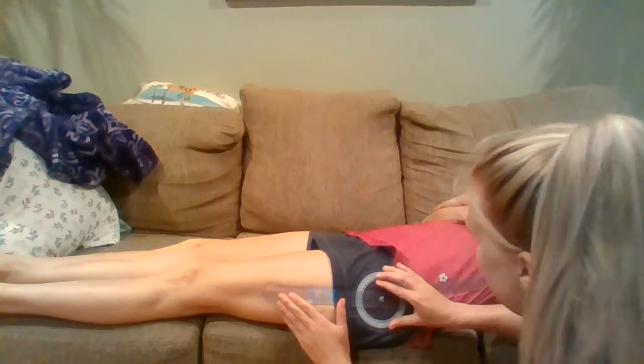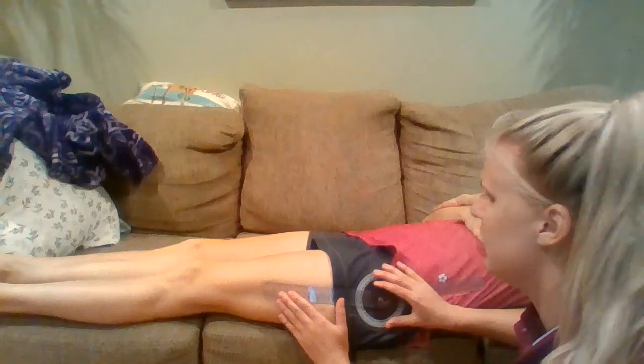If her knee is straight, that is another form in which to measure hip flexion, but that is also involving the flexibility of the hamstrings, and I don't want to be measuring that. I only want to be measuring the flexibility at the hip. So I'm going to ask her to bend her knee so those hamstring muscles are on slack. So with that said, we're starting right here, and go ahead and flex your hip up, making sure to bend your knee.